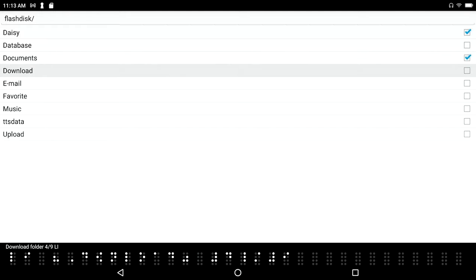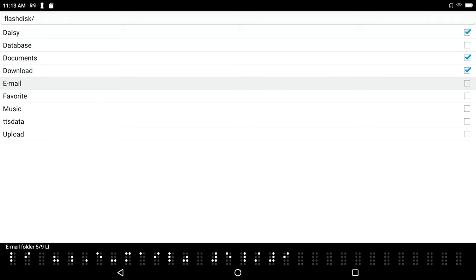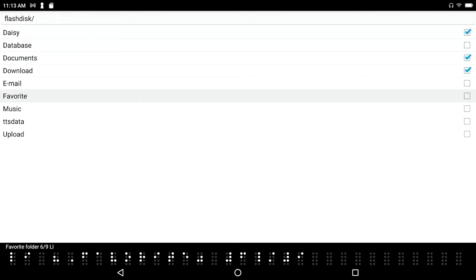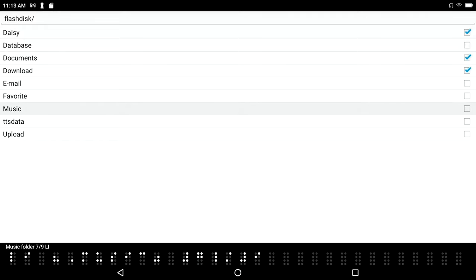Selected download, email folder 5 of 9 list item. Email, yeah okay, I mean I really don't care because I use IMAP and all my emails are sitting out on the server somewhere. Favorite folder 6 of 9, so I'm not going to select that. Music folder 7 of 9 list item, music.